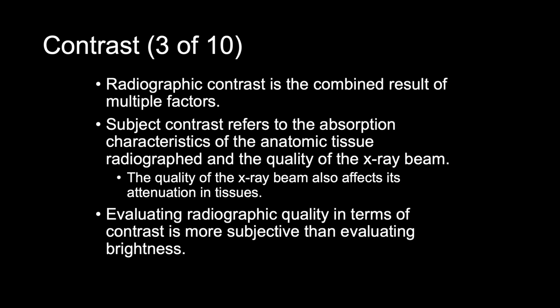Radiographic contrast is the combined result of multiple factors associated with the anatomic structure, the quality of the radiation, the capabilities of the image receptor, and in digital imaging, the computer processing and display. Subject contrast refers to the absorption characteristics of the anatomic tissue radiographed, and the quality of the X-ray beam.